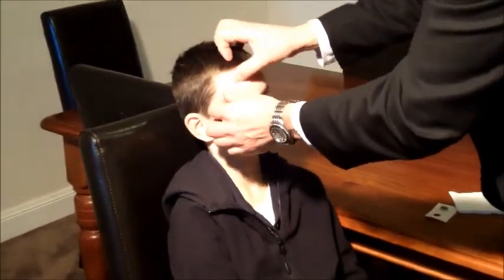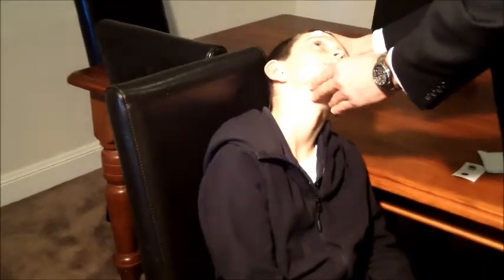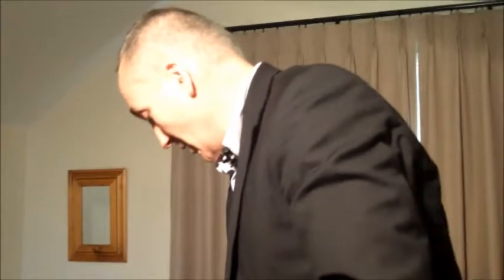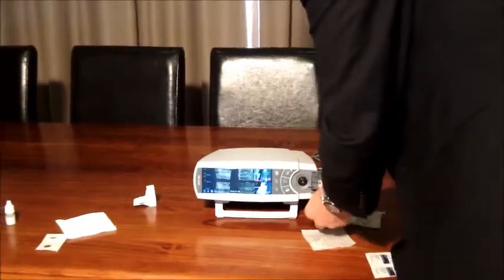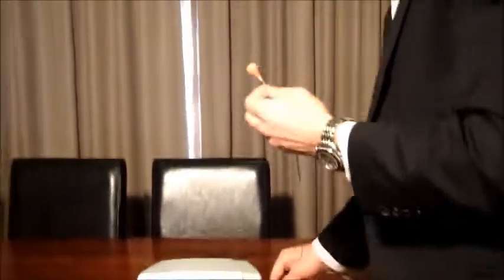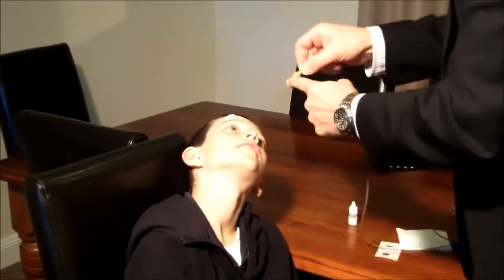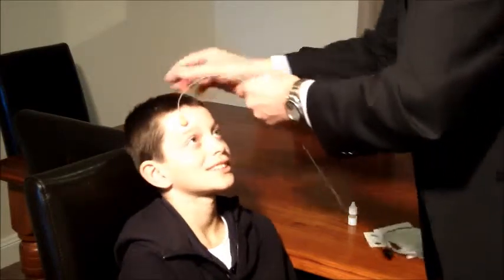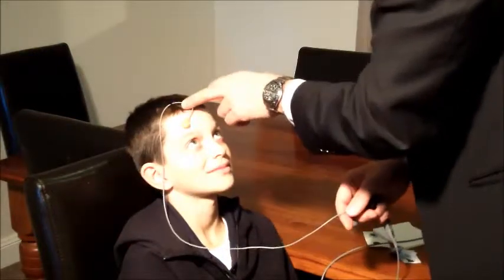Micropore doesn't like to stick to wet alcohol, so we either leave it to dry or give it a dab. Then we grab our attachment ring, peel it off, and stick it just above the eyebrow, tapping it all the way down. With the patient's head positioned so the attachment ring is roughly horizontal, we put one drop of contact gel - just one, because two drops causes it to come out the side. We grab the probe from the docking station, close the docking station door, slide the probe in front-ways and clip it in to spread the contact gel around. The cable can go anywhere you like on a swivel.